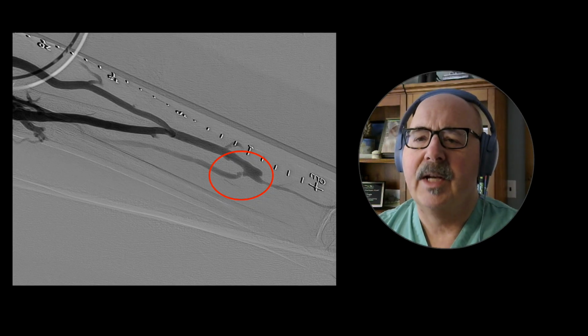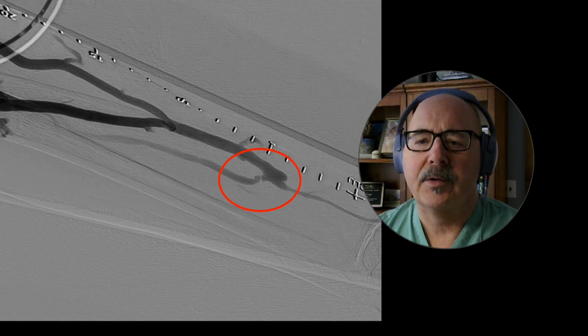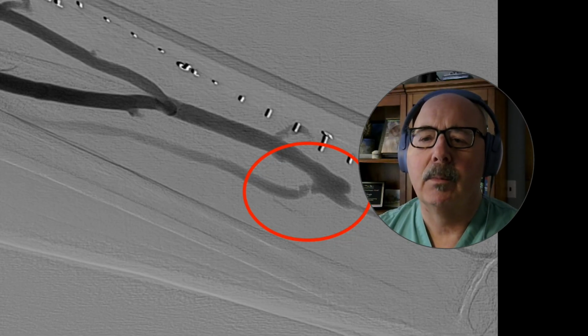Dialysis access creates an abnormal hemodynamic system due to the steep pressure gradient from the arterial to the venous side of our circulation without the hydraulic dampening of a capillary bed in between. Expect high velocities and disturbed or turbulent flow proximally and at bends and decreases in diameter. Volume flow is complex and it relies on several assumptions. Is it perfect? No, but it's reproducible and comparable over time when done correctly and consistently.